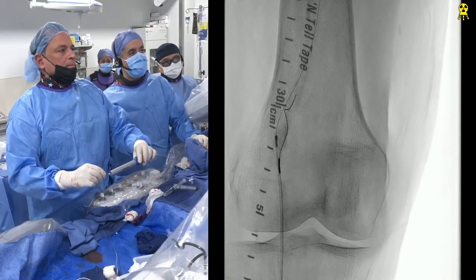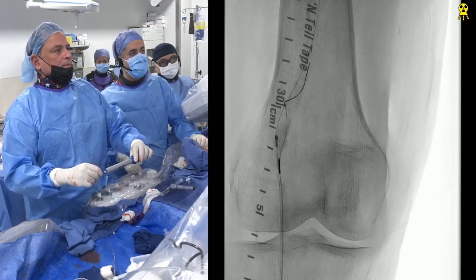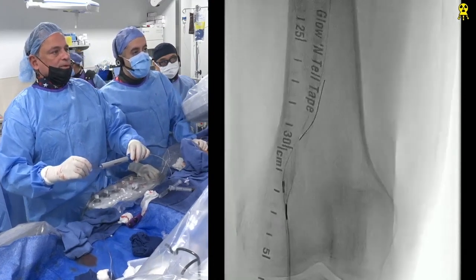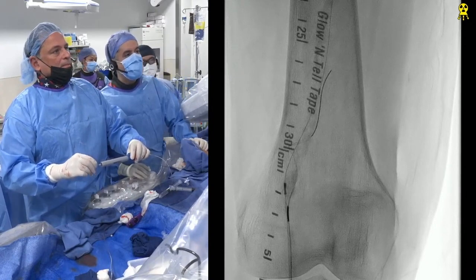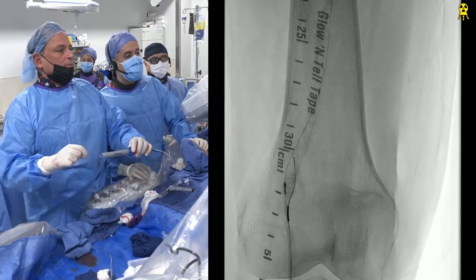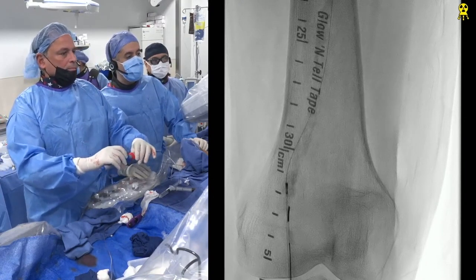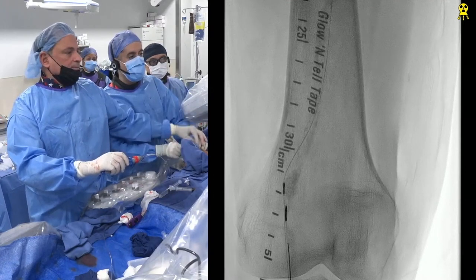Who knows? Yeah, that's what I'm saying. It's just firing. That's what I'm just trying. I'm trying something different here. Because that looks like it's outside. Well, I know, Karthik. I'm just trying to get a different plane, brother. I know, but that's way outside. The other thing you can do is just try to slowly pull back the needle, like not fully release it, and see if you poke right into the right plane. Push it up now. Yeah, that's what I'm trying to do.